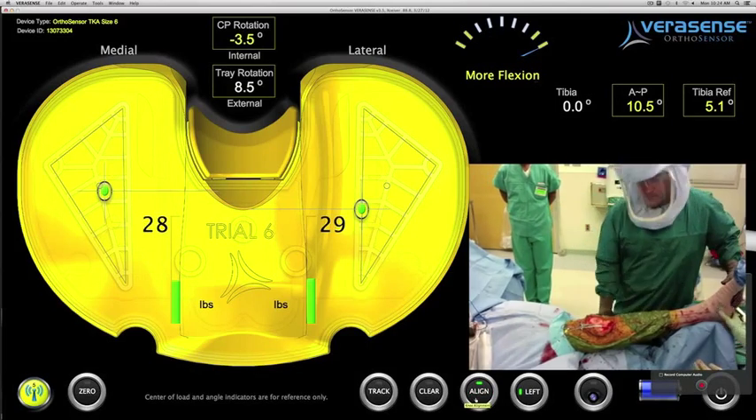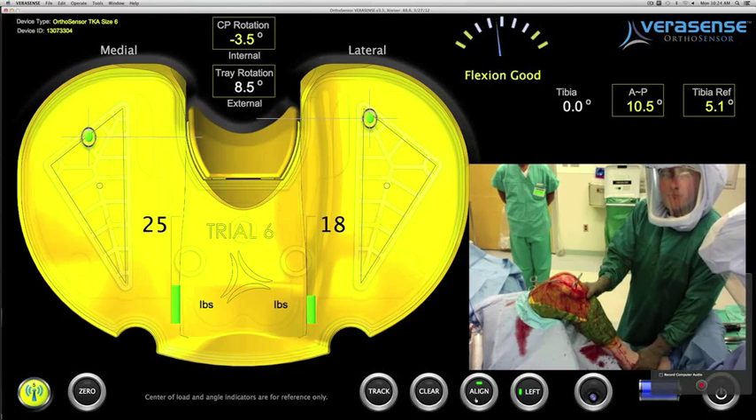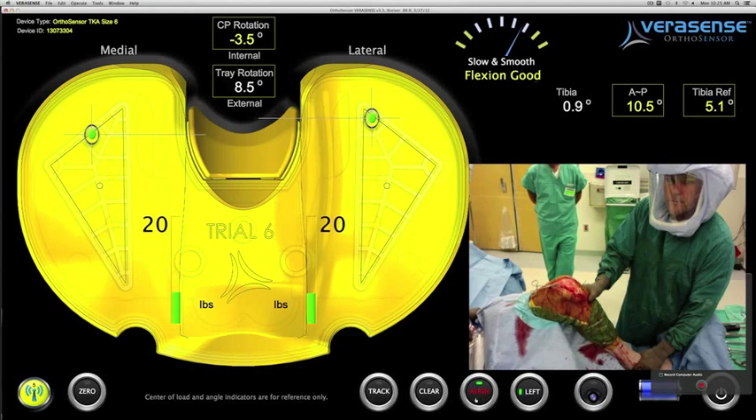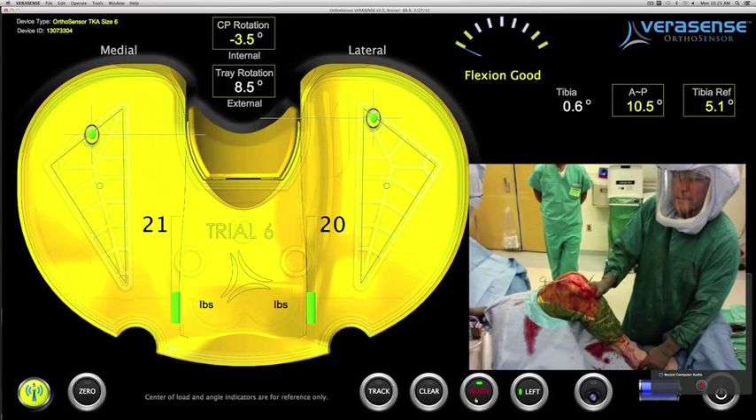The surgeon takes the knee into extension and improved compartment balance both in flexion and extension are seen. The surgeon rechecks his cut, which was in 2.8 degrees of valgus prior, to see how much varus he has corrected.